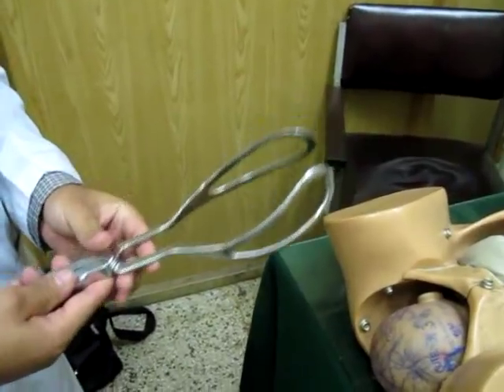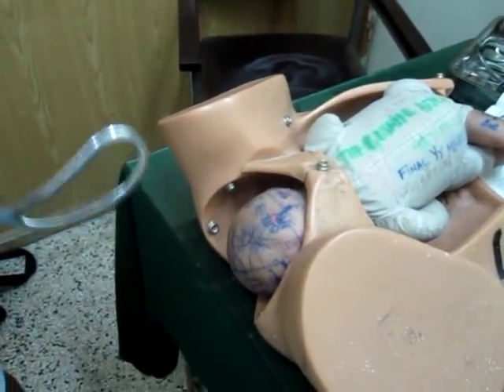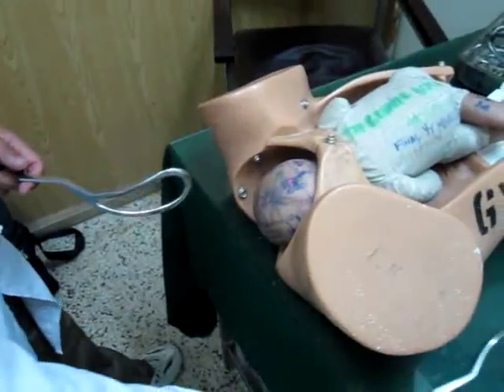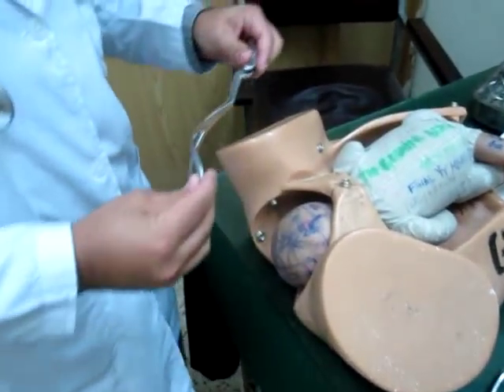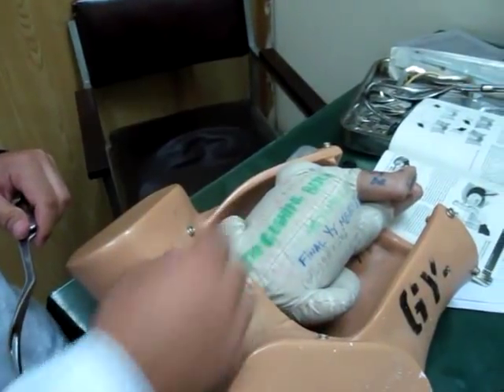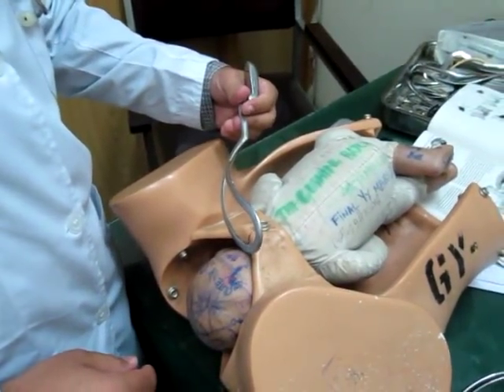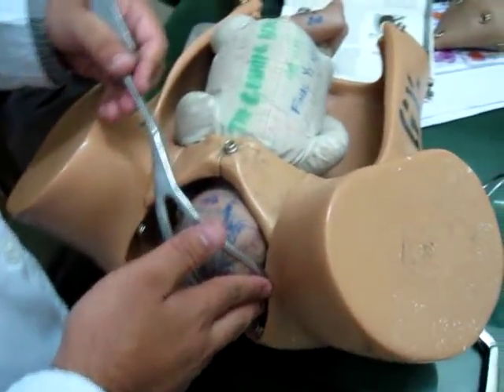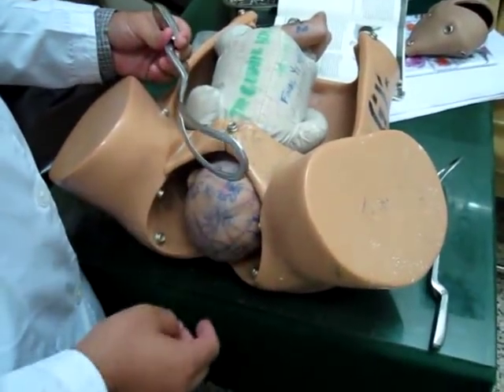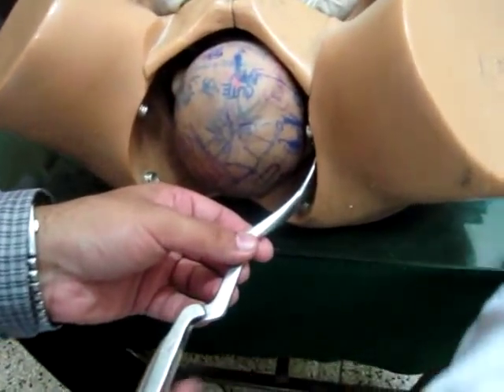For the method of application, you can see that crowning is already happening. You take one forceps and give it to your assistant. There is the inguinal ligament which passes between the anterior superior iliac spine and the pubis. You hold the forceps in the axis of that ligament like a pen, and then guide it into position. Once it is positioned, you hand it over to your assistant.